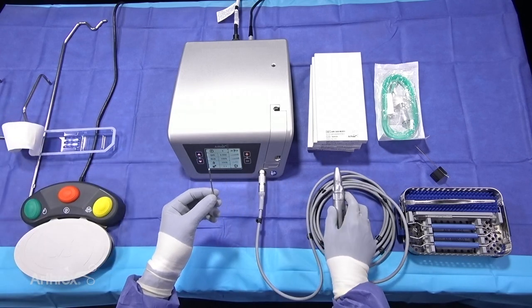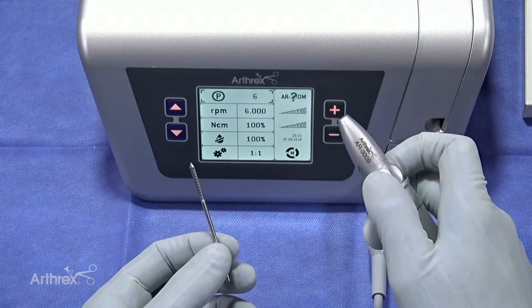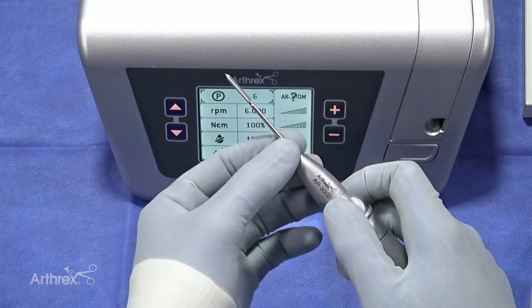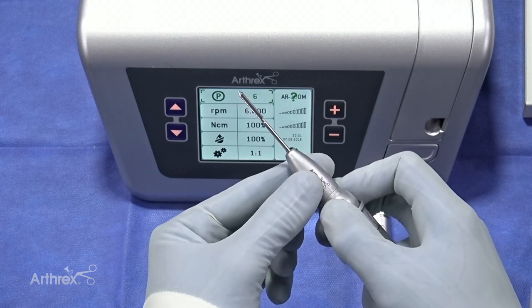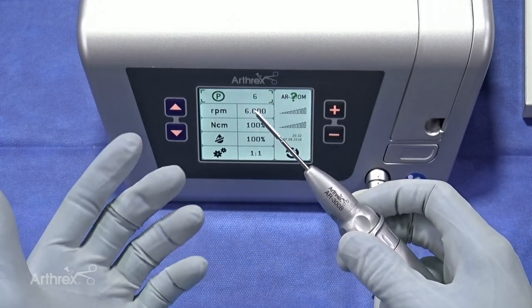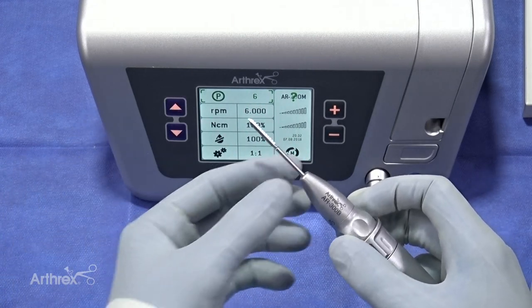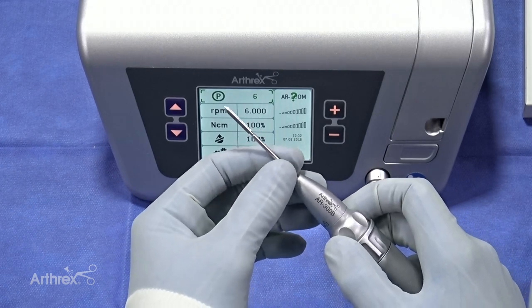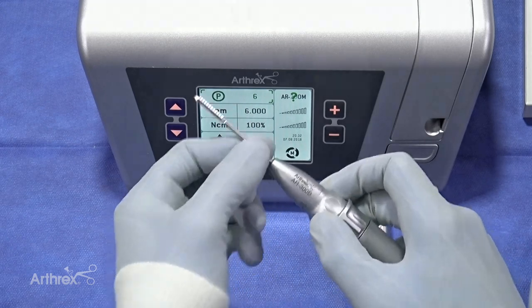When attaching the burr, the AR300B has a locking mechanism. You simply turn the locking mechanism counterclockwise to open it up, slide in the burr attachment, and lock it clockwise — and you feel a very tactile click. The burr is now locked in. If you're doing a case on a patient with a rather large foot, you can adjust the length of the burr accordingly. Simply unlock it, find the length needed, and lock it back in.